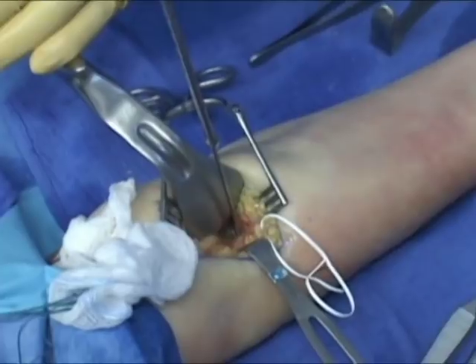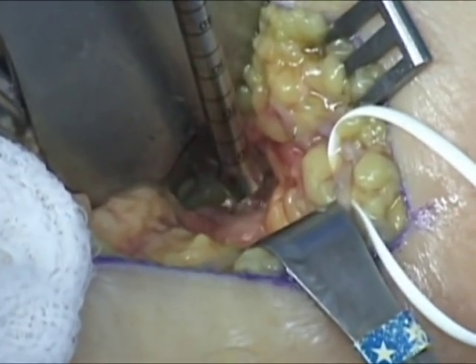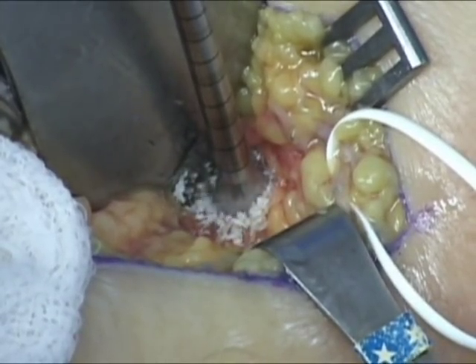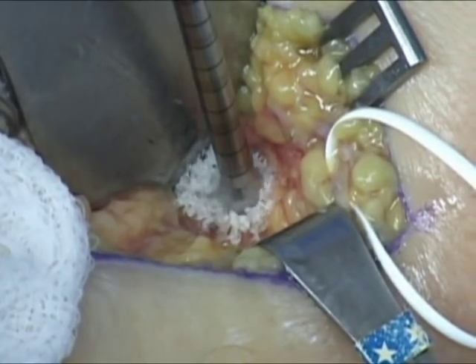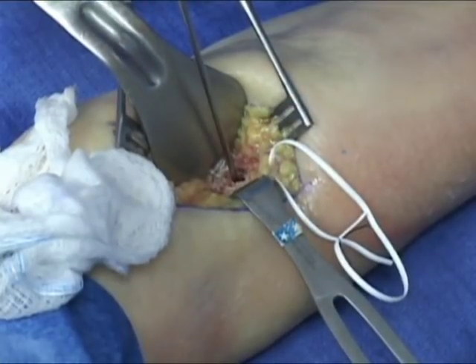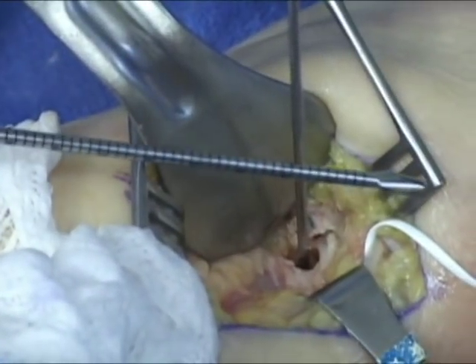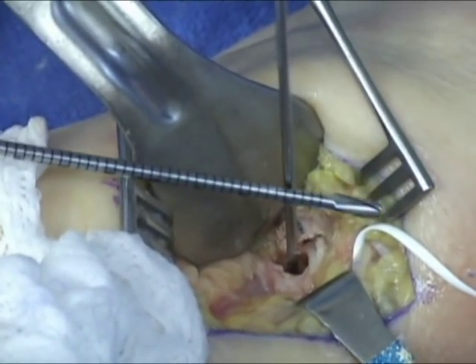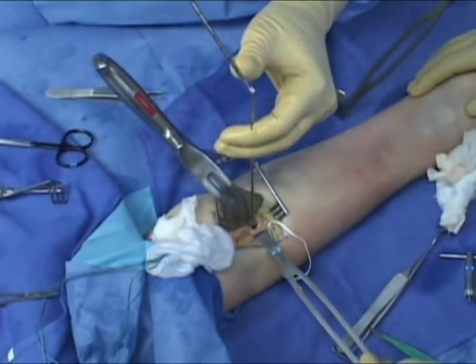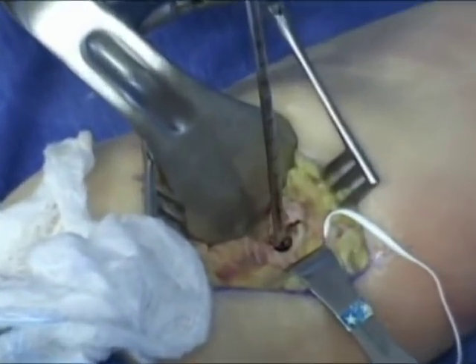The drill is then advanced along the guide wire to drill only the anterior or near cortex of the radius. It is extremely important to protect the posterior or far cortex of the radius at this time. Meticulous removal of all generated bone debris is performed, and a thorough irrigation should be carried out. The cannulated 4 mm endobutton drill is then chosen to drill the posterior cortex of the radius over the guide wire, advanced just through the posterior cortex and stopped to prevent injury to any posterior structures.